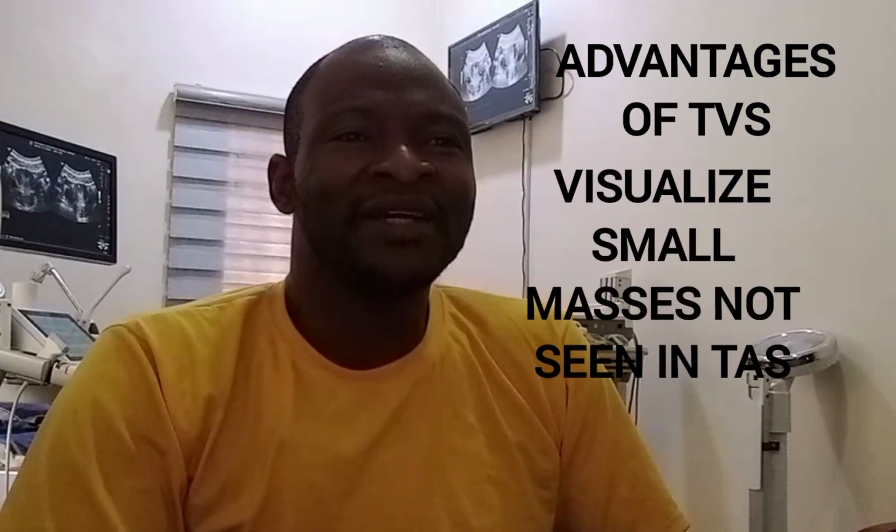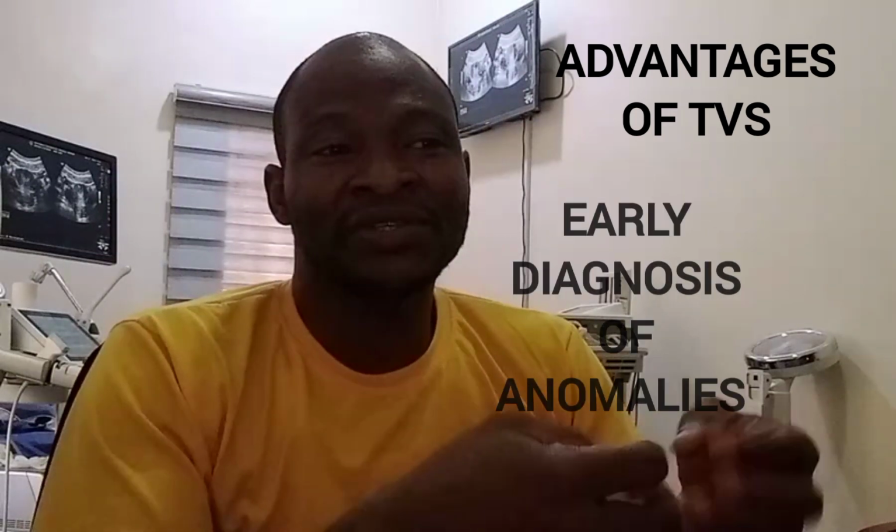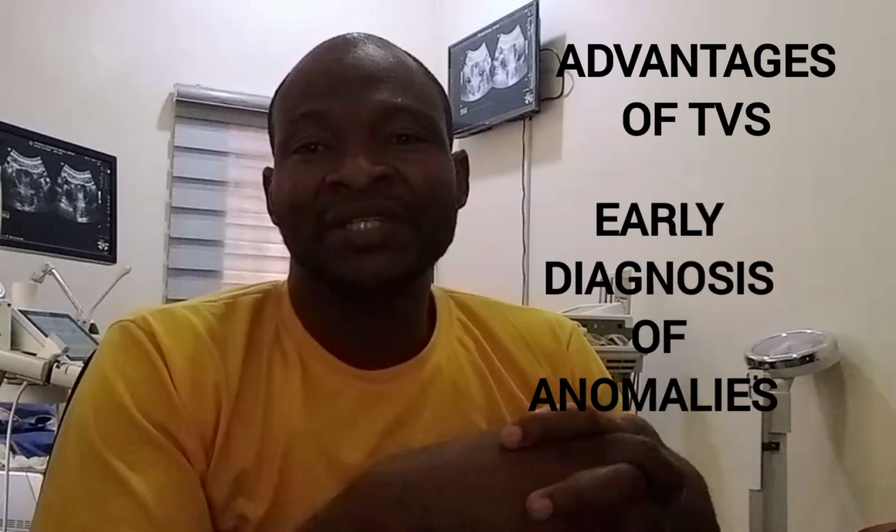It allows earlier diagnosis of intrauterine and ectopic pregnancy, about 1 week before you see it in a transabdominal exam. It permits better visualization of the embryo and its morphology in the first trimester and early second trimester, and it allows for early diagnosis of some congenital anomalies.